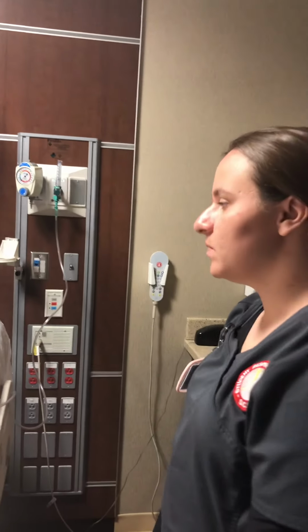Alright, I'm going to do an O2 scenario. So the first thing I'm going to do is check the patient's chart. And so I checked the patient's chart and I noticed that they just got out of operation and they had a nasal surgery done. And so I'm going to go in and check on the patient. So I knocked on the door, introduced myself, and I noticed right away that they are not on the appropriate device that I think would be best for them, especially after they just got done with nasal surgery.